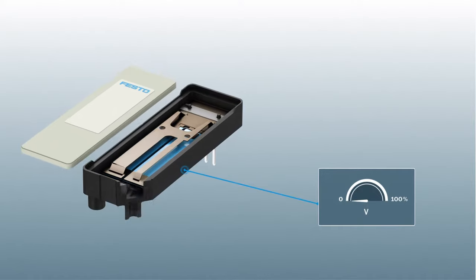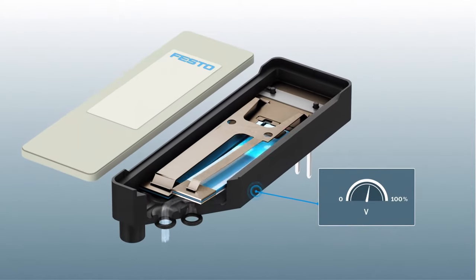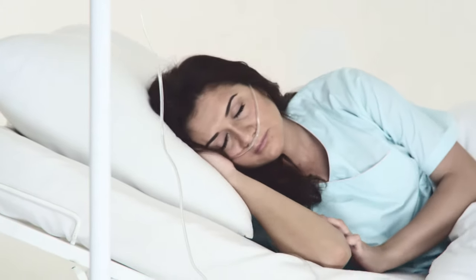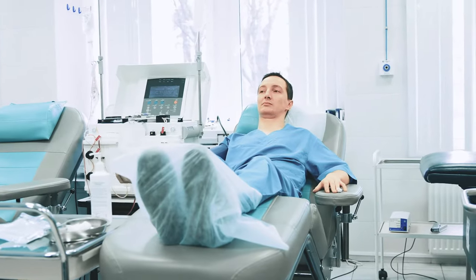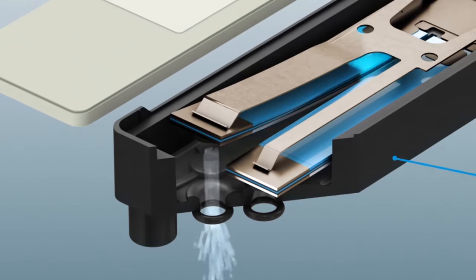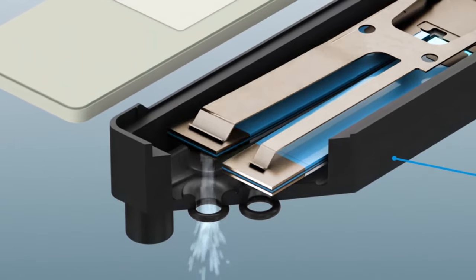Three three-way proportional valves are used, for example, to regulate the flow or pressure in oxygen therapy, ophthalmology and dialysis. These have two bender actuators to accurately regulate gas as well as pressure.